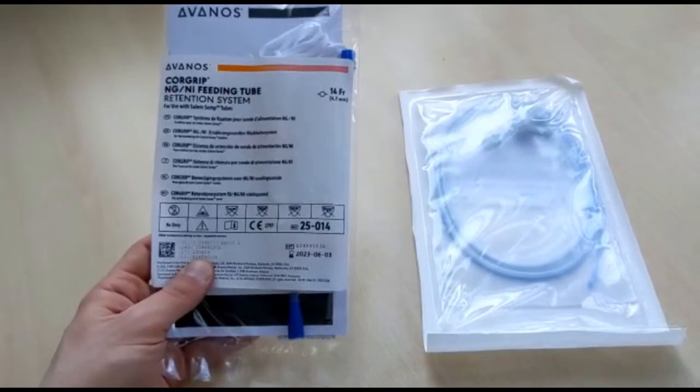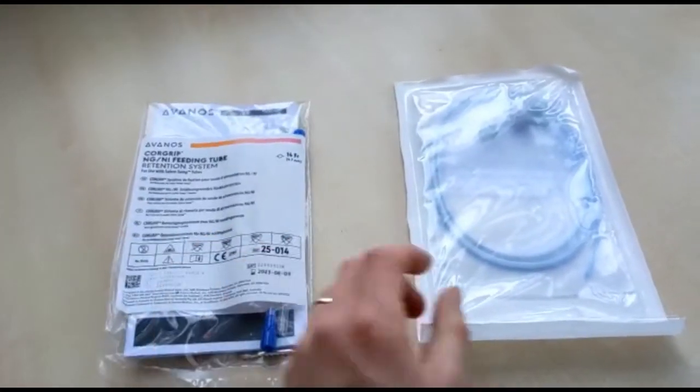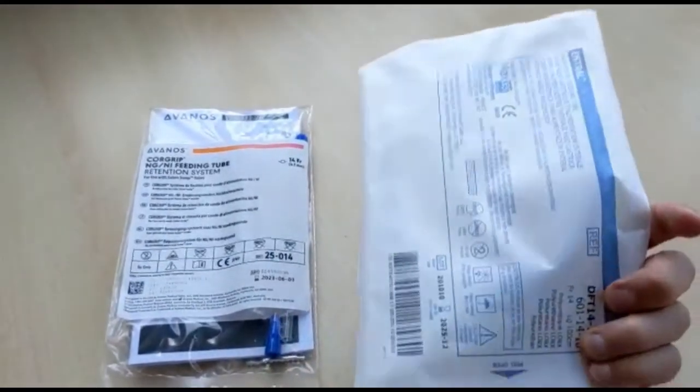The bridle kit should be used with a 14 French feeding tube. 14 French tubes are the standard size in critical care to allow easy suction and feeding without blockage.